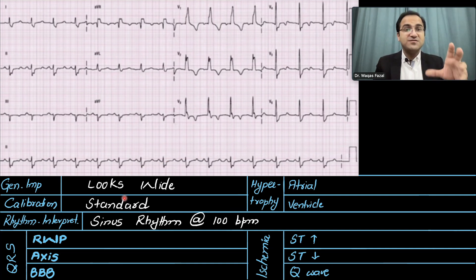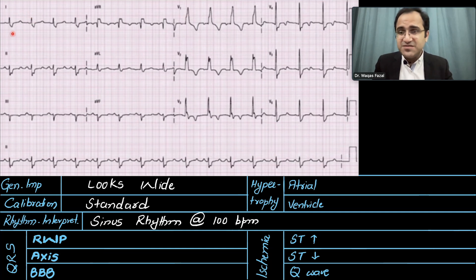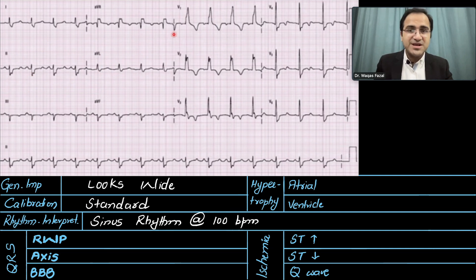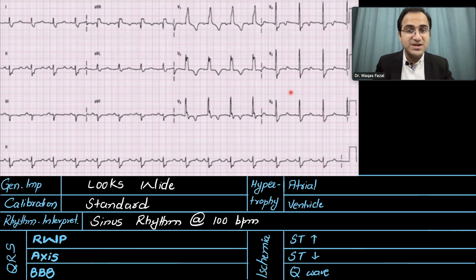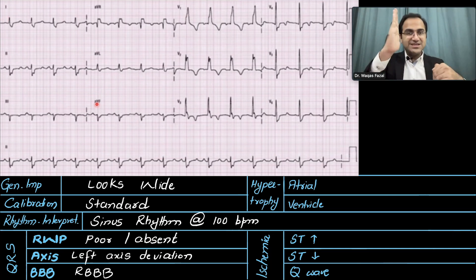Now let's look at the R wave progression. In the hexaxial leads except AVR, all QRS should be positively deflected upward. Lead I is positively deflected, lead II is negatively deflected, lead III is also negatively deflected, AVL is positively deflected, AVF is also negatively deflected. So this is poor R wave progression. In the precordial leads, V1 and V2 should be negatively deflected and V5 and V6 should be positively deflected — but here they are positively deflected in V1-V2, which is not normal. R wave progression is poor and even absent. Now let's look at the axis using leads I and AVF — they are leaving each other, which indicates left axis deviation.